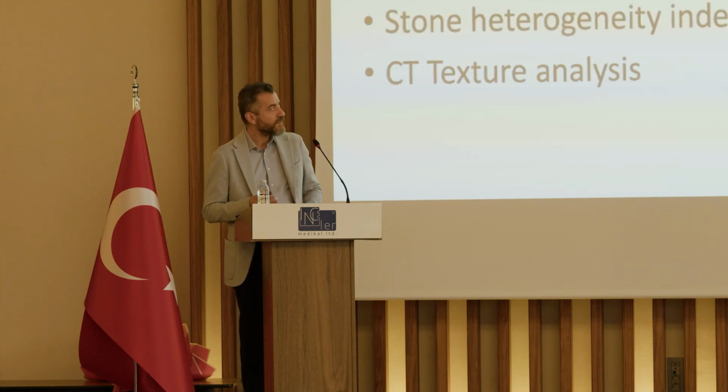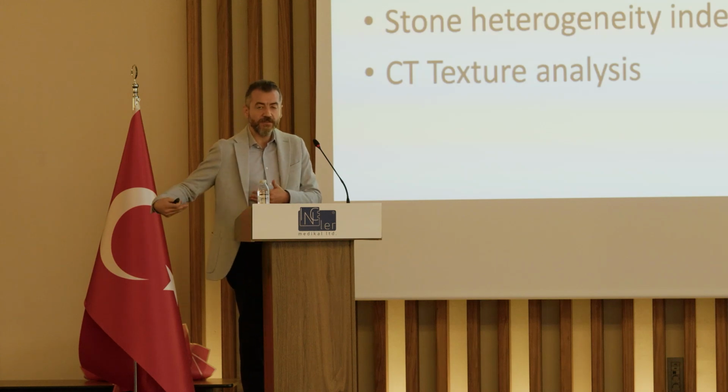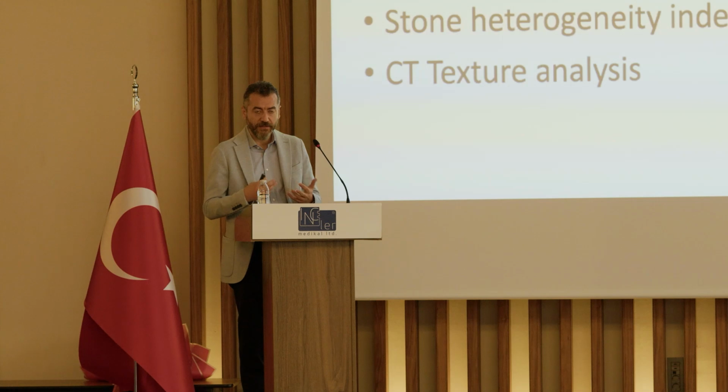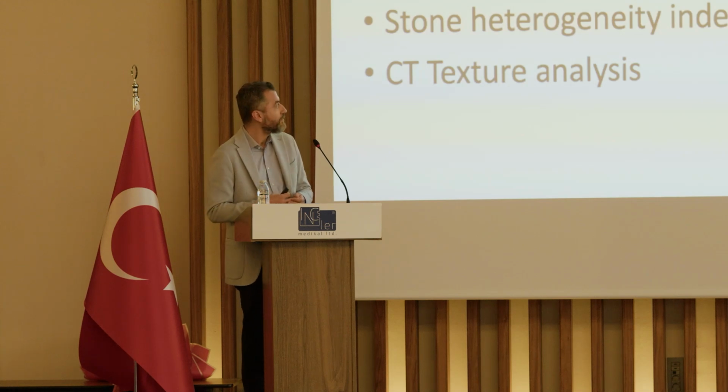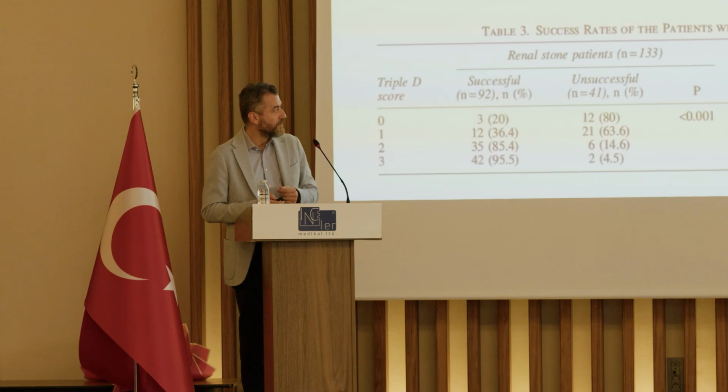So proper patient selection is important, and we, as physicians, need to be well informed about the indications and the contraindications of shockwave lithotripsy. And while selecting our patients, we need to take into account a lot of factors like the stone size or the 3D volume of the stone, the location, and the skin-to-stone distance, which has a very important effect on the application of shockwave lithotripsy. Also, there are other parameters like the enhancement in the CT texture analysis. These are all things that we now calculate and study for the shockwave lithotripsy procedure.